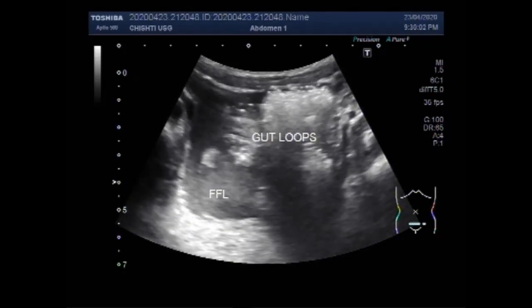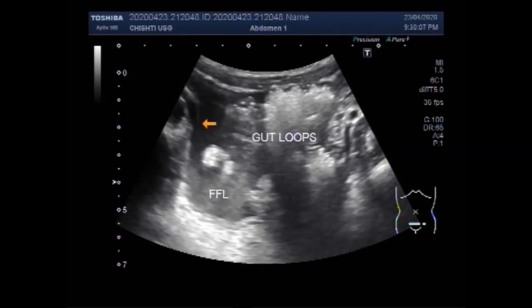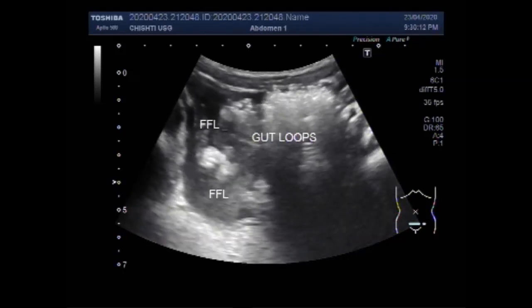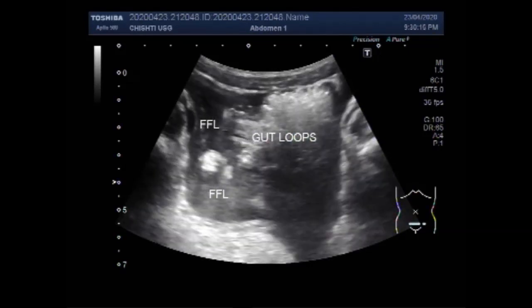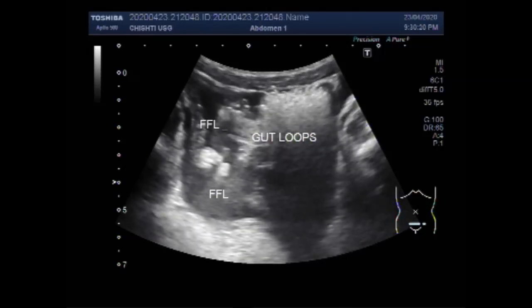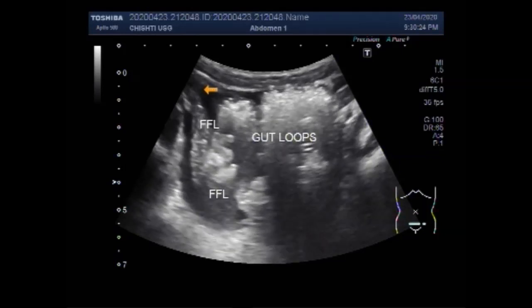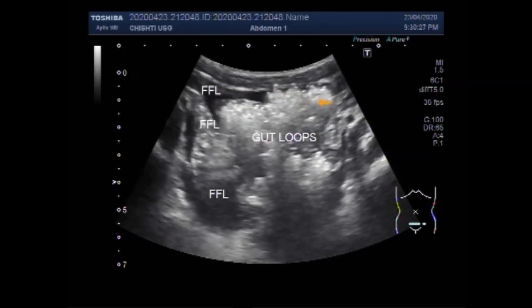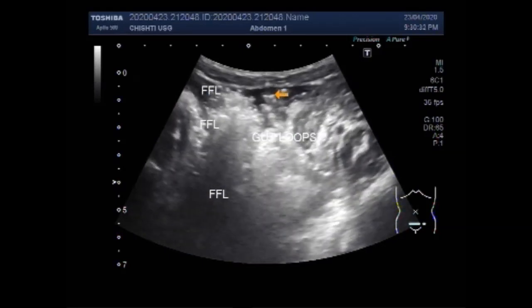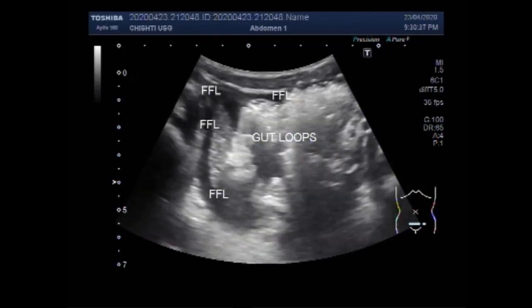You can see a significant amount of fluid in the lower abdominal cavity, and the fluid is thick and turbid, due to the traumatic injury in a child aged about 7 years. And you can see the thick, free fluid seen in the lower abdominal cavity.